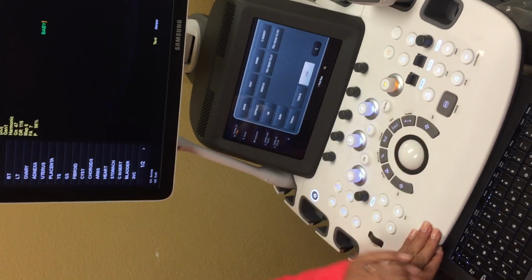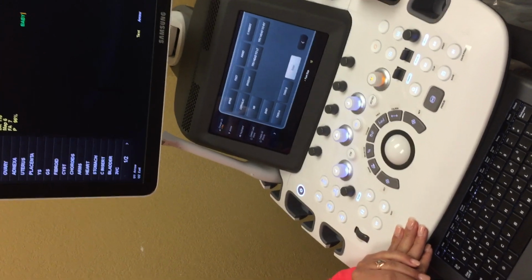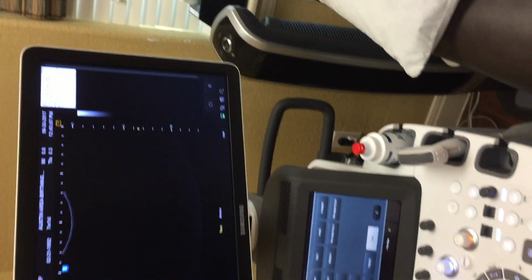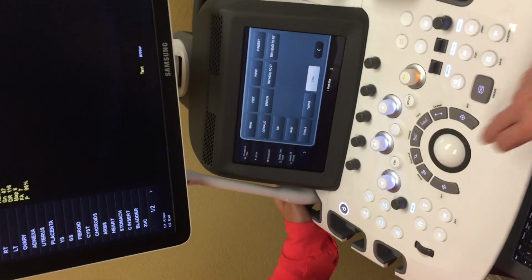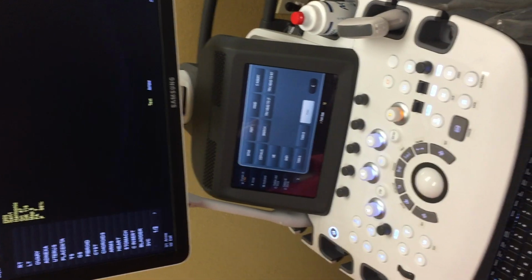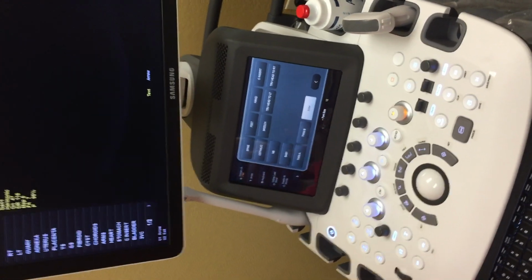Oh, nice. That's helpful actually. I want to annotate that because I'm not a photo. So if you're trying to annotate, you would move the mouse to the thing that you're annotating and check it. Exactly. That's right. Okay, great.